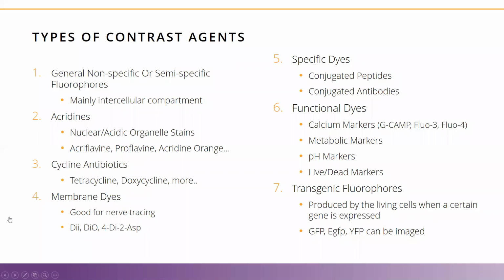Now, I used acriflavine for two reasons. One, it is very economical, it's not expensive. And second, it is also biosafe. We do not have a dedicated wet lab, so we have to use something that is biosafe. But you can use any dye you want. I have listed some of them here. You can use membrane dyes, specific dyes, functional markers, pH markers. If you are working with GFP or YFP, that also works excellently with this instrument.